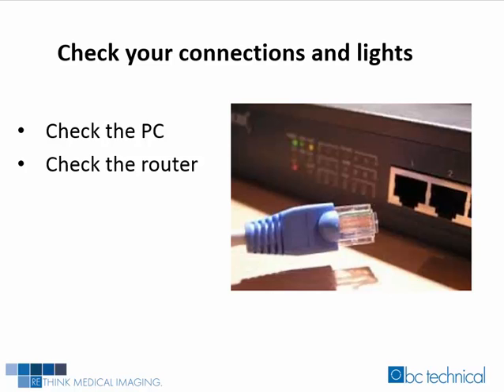This is another effective troubleshooting tip that we just take for granted. Are the Ethernet cables plugged in, or do we have connectivity? Do we have a green light on the Ethernet connection to the PC, or do we have an amber light? A solid green light indicates connectivity and presence. A flashing green light is a sign of intermittent connectivity, which is a fancy way of saying one minute the PC is on the network and the next it's not. A flashing amber light indicates collisions. You'll see this flash occasionally, even on a healthy network. But you don't want to see a flash so often that it looks like a solid amber light, which indicates no connectivity.